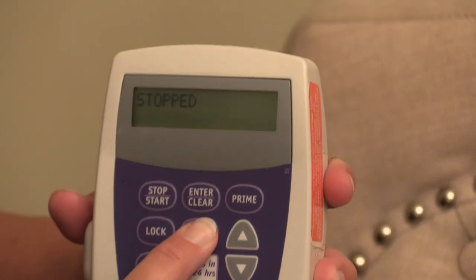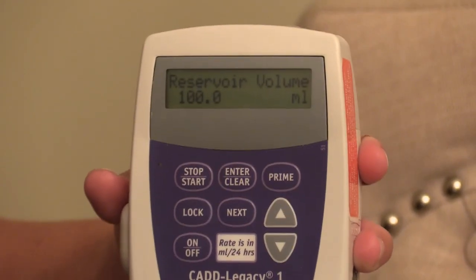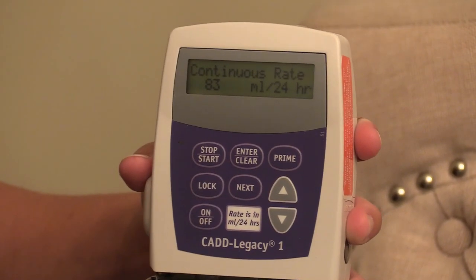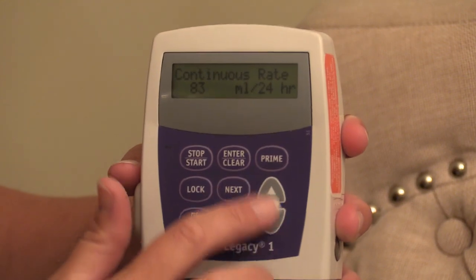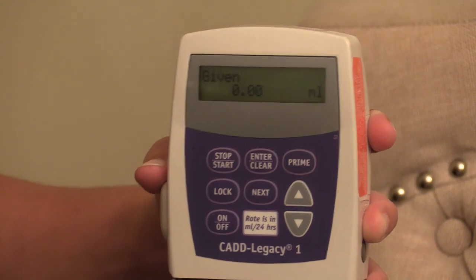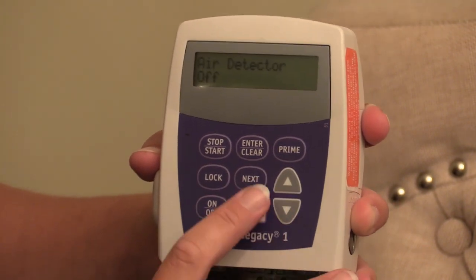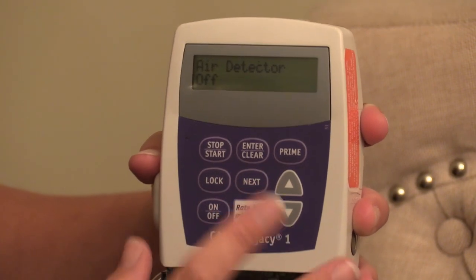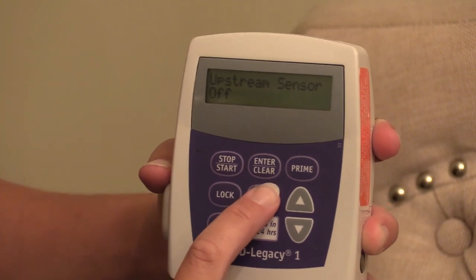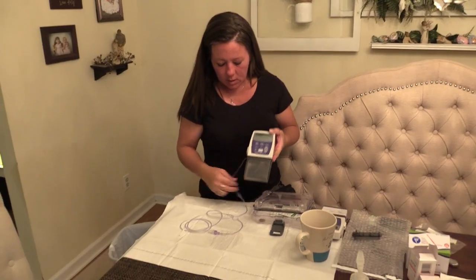When you turn it on it goes to stopped. Press next — it tells you the reservoir volume is 100, that's how much is in here. Press next — it tells you my rate, and I'm at 83. You can go up and down if you need to and press enter to save it. Next is 'given' — it hasn't given me any yet so it's at zero. Air detector off — you don't need the alarm on unless you prefer it.